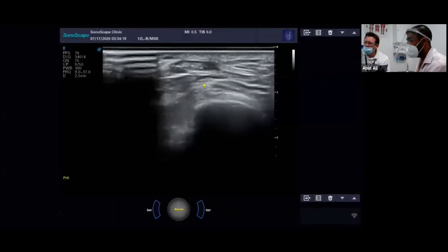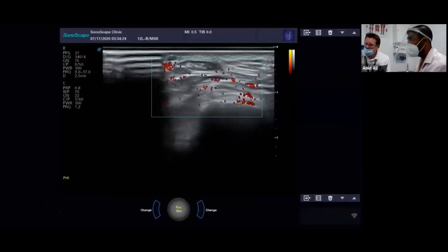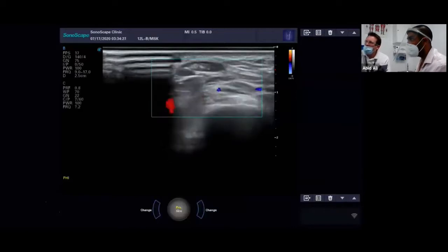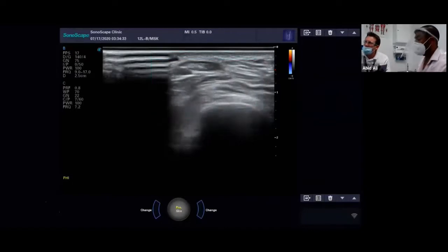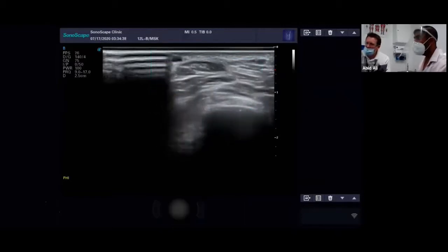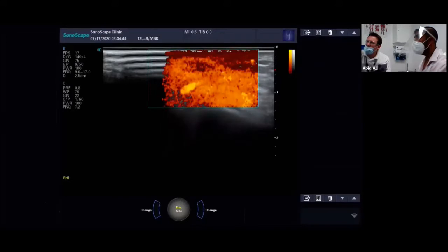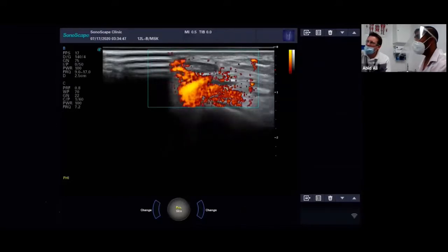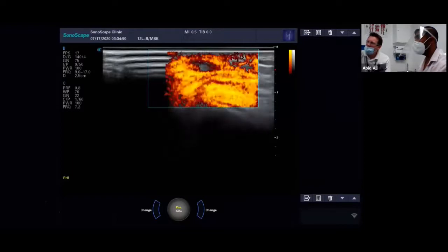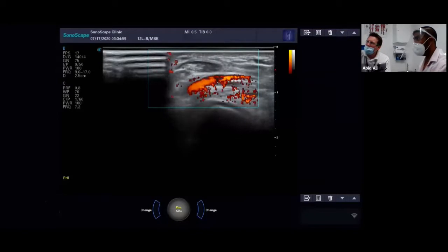And I always tend to use power Doppler, which is that one, because it's a little bit more sensitive than this one. But you can use both, but if you're not picking anything up when you've optimized it with the frequency, then just pop it onto power Doppler and see if that makes a difference. It usually does. So that's the orange one. That's independent of direction, so that's picking up movements in any direction. So if I move the probe, can you see all the interference there? So you've got to be absolutely still with your probe on the structure. What you're seeing there is a little bit of the dorsalis pedis.